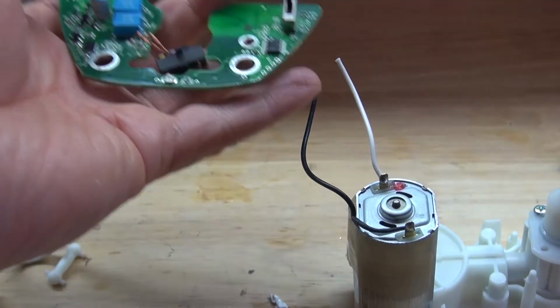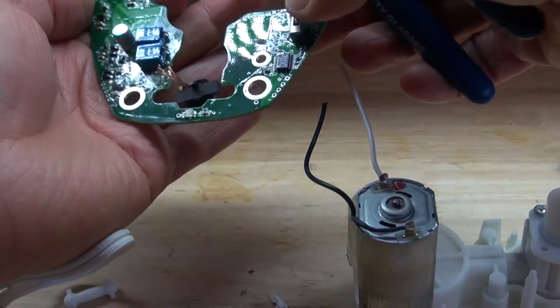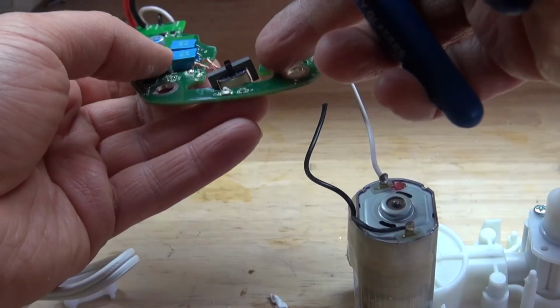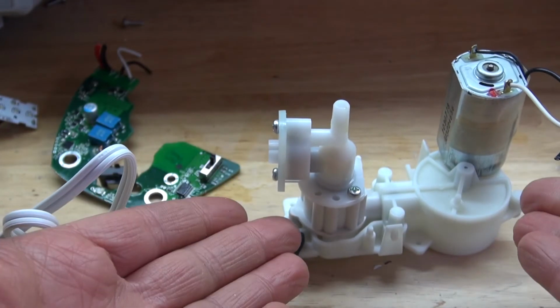Cut the wires on the DC motor. This circuit could potentially be useful for something. So I'm going to go ahead and keep it for some of the components and keep it for that transformer. And this water pump can definitely be useful for something.